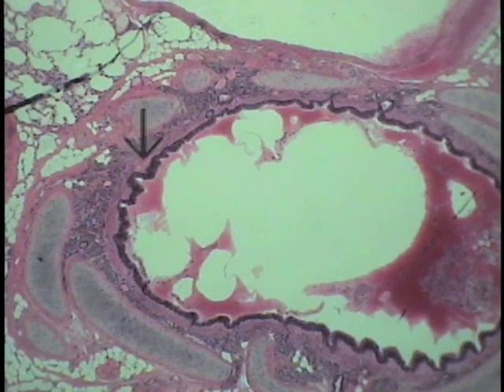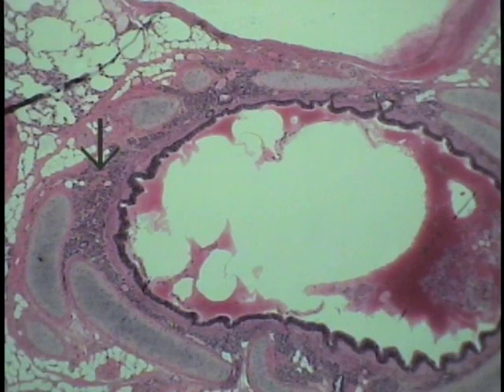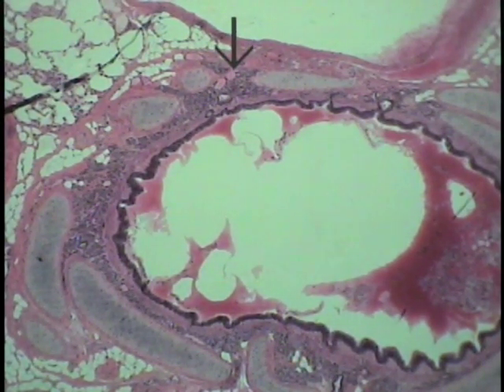At this particular position, it is going to subdivide the connective tissue component into little areas, little folds. That connective tissue that supports these folds is the lamina propria. You then have this band of bronchial smooth muscle, and then the bronchial glands. In this case, they're very similar to the tracheal glands, but because they're in the bronchi, these bronchial glands are going to be in the submucosa between the plates of hyaline cartilage and that bronchial smooth muscle usually, though you can see some have been pushed out and actually lie down between cartilaginous plates.